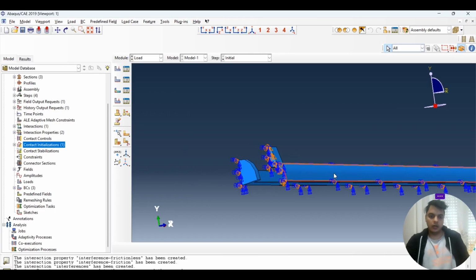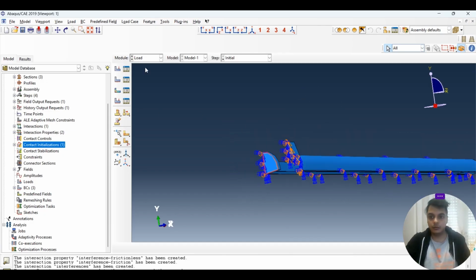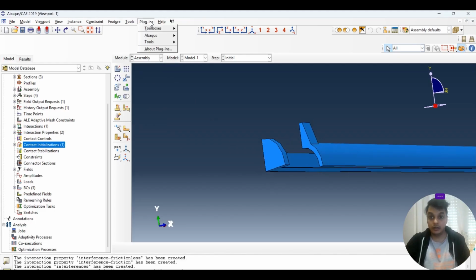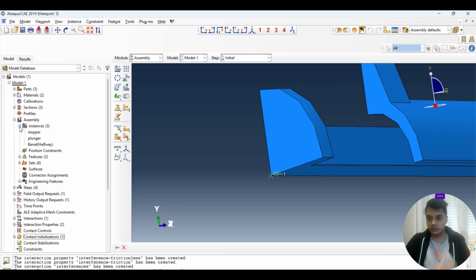It's fixed here. Now we want to apply another load, that is a displacement, to the plunger. So now here what we have to do, we have to couple all the points and put a reference point here. For that, we have to go to the assembly part initially, and define the reference point. So this is our reference point here, let's say. I define it. You can also rename it, but it's all up to your call.